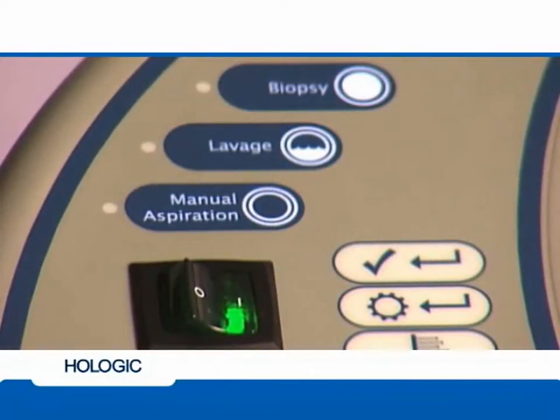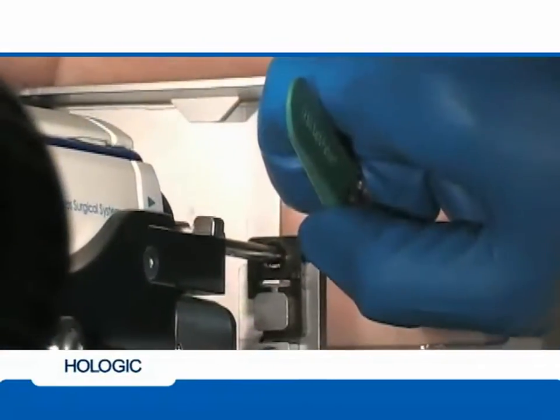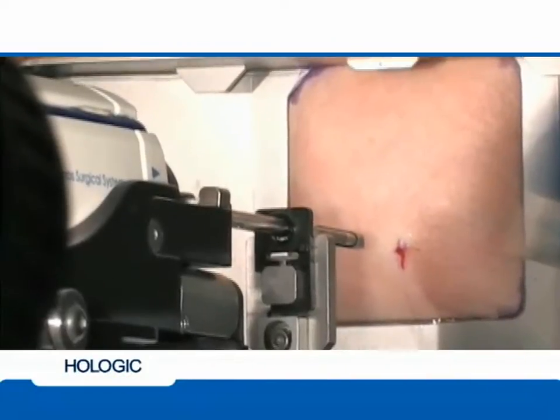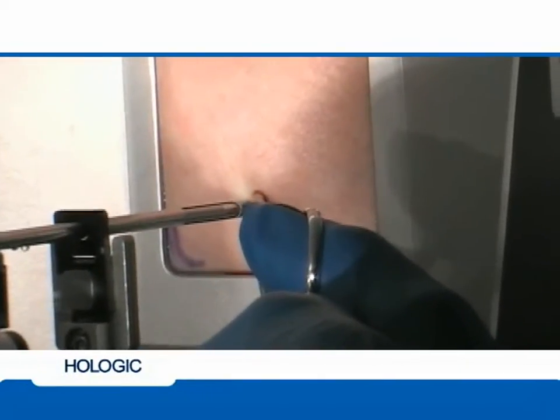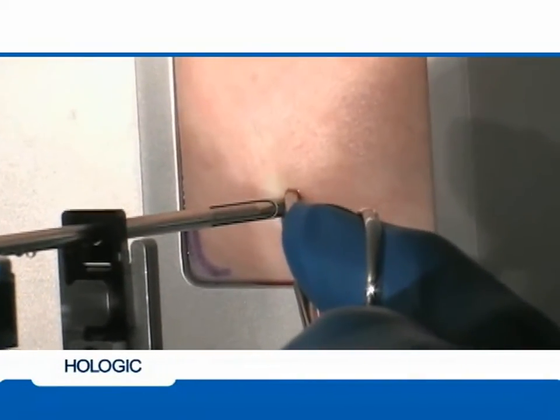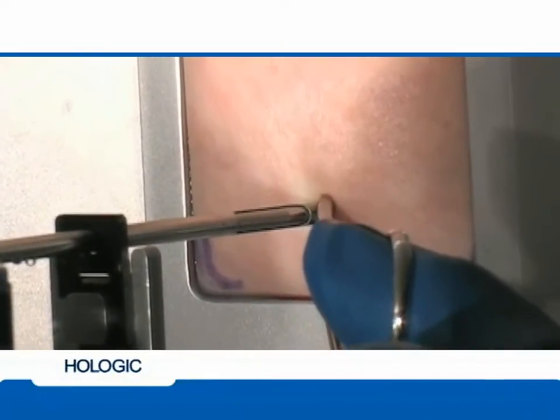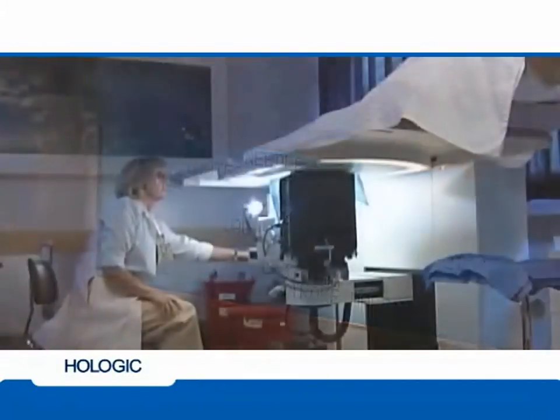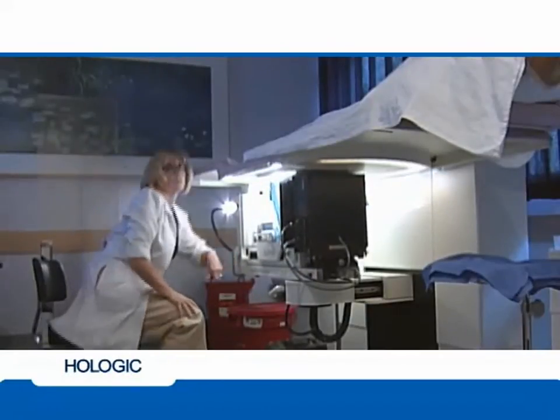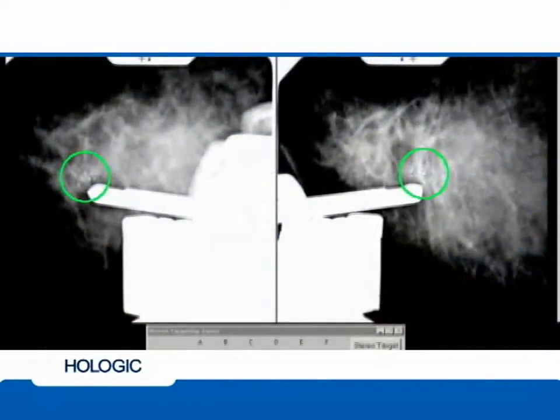Turn the ATEC console on, which automatically closes the aperture and prepares the needle for insertion into the breast. A skin nick is made by a surgical blade to allow easier entry prior to advancing the needle to the biopsy site. Manually advance the needle into the breast until the Z column of the differential line reads minus 2. If compression is below 32 millimeters, use a petite aperture needle and advance to minus 6 on the differential line. Before firing the ATEC stereo adapter, take a pair of pre-fire stereo images to determine that the area of interest is correctly targeted. Activate the view stage cursors to ensure that the injection of anesthetic has not caused any lesion movement.